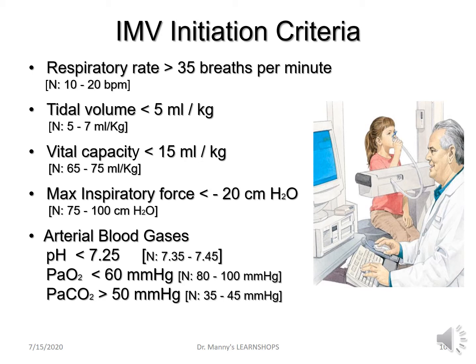What are some of the initiation criteria to consider for invasive mechanical ventilation? This is variable.